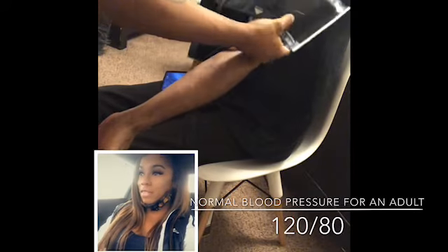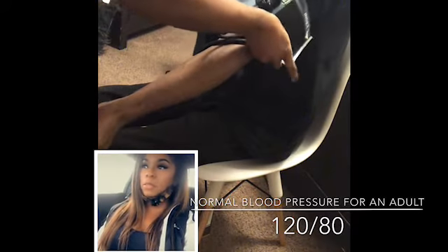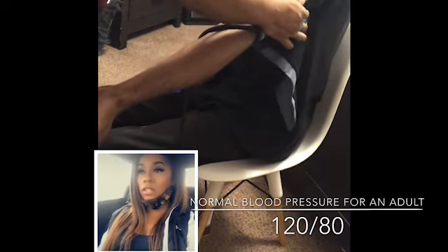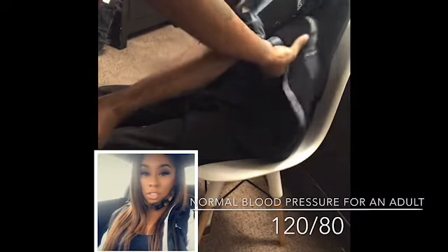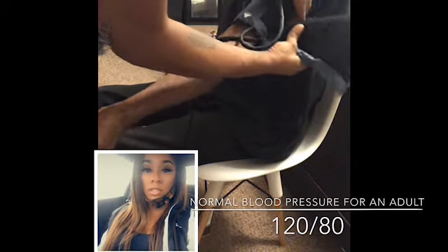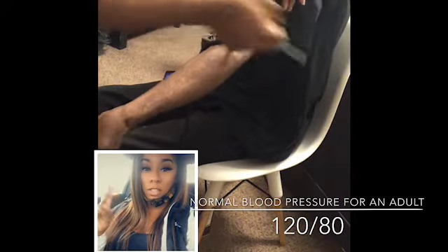Okay, so when doing blood pressure, this is a whole other ballpark, but when doing blood pressure, you want to make sure that their legs are not crossed. You want to make sure the blood pressure cuff is snug and tight, not too tight but not too loose either. You want to be able to put 2 fingers underneath.